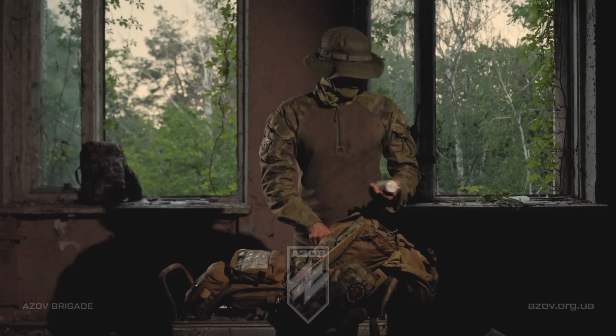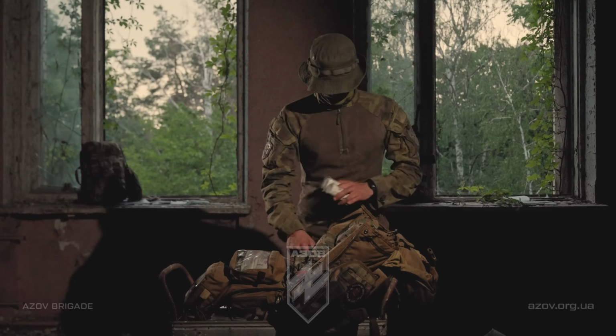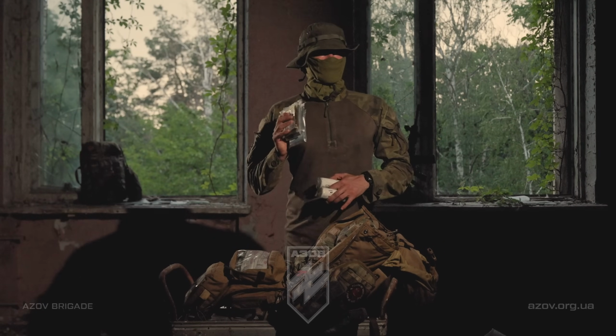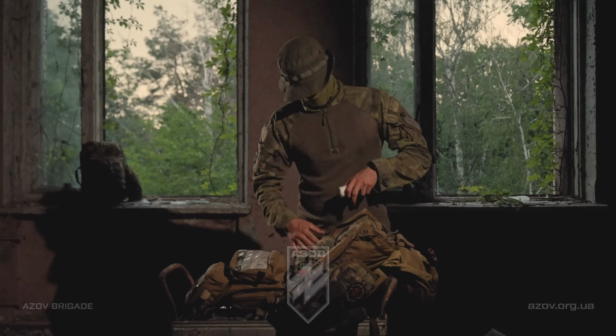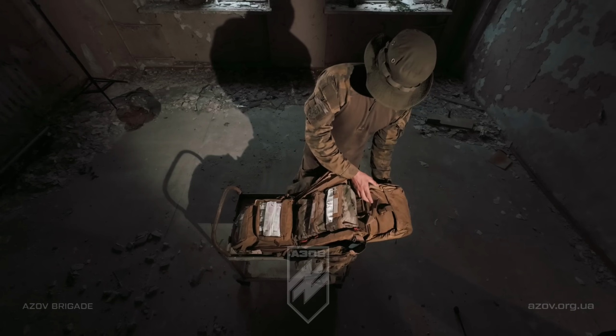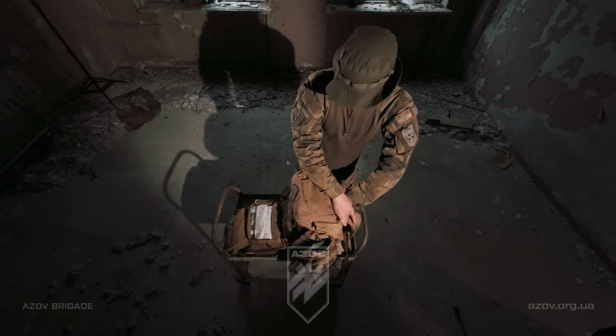In here, you're going to see I just have ace bandages, some other bandages for small boo-boos. I also have a load of mylar blankets or emergency blankets in there for hypo. They go in tandem with the active and passive methods we have. I think, to be honest, in that bag, that's everything I carry here.